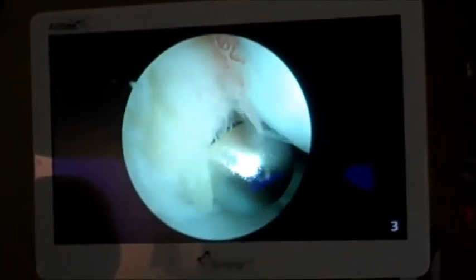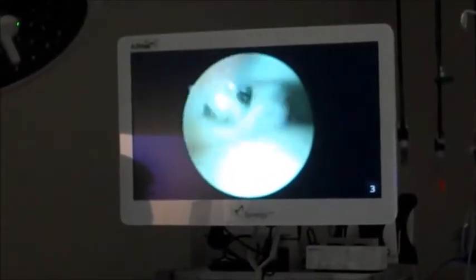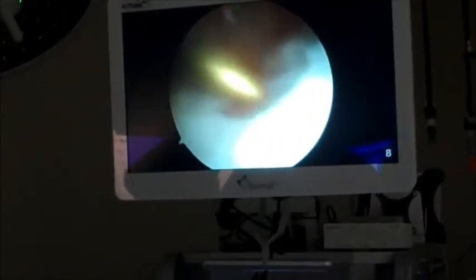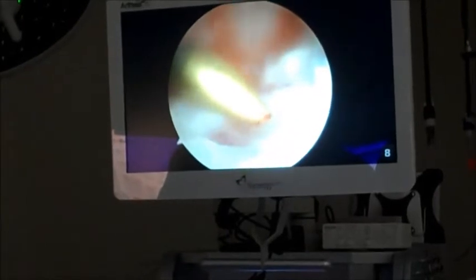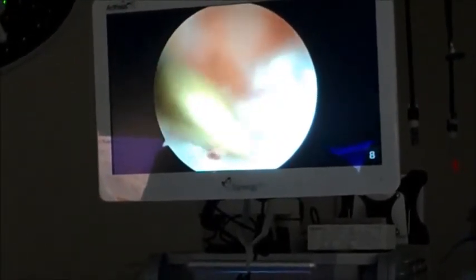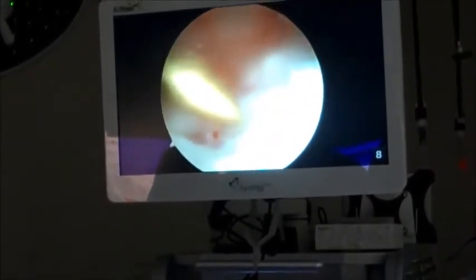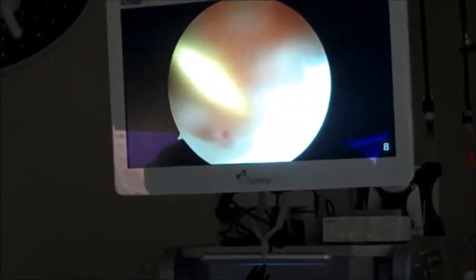Once we're finished with that we'll find the defect and we'll actually drill into that to help stimulate blood flow. This is the area where the patient has their defect, and you can see right here I'm actually touching hard bone. Surrounding this is actually cartilage. Our goal is to make a small hole in this, and that should start bleeding, which will cause new cartilage formation.